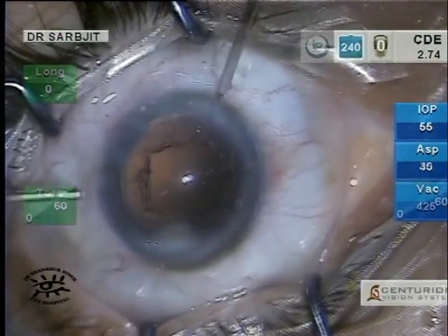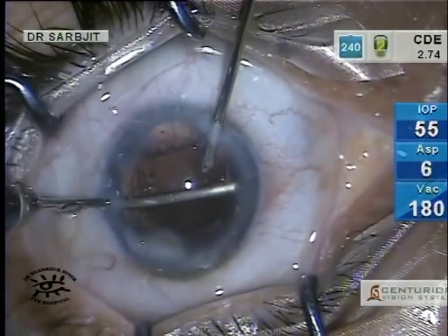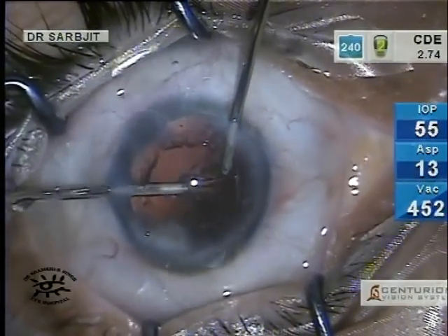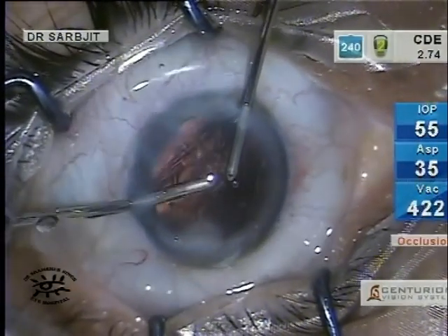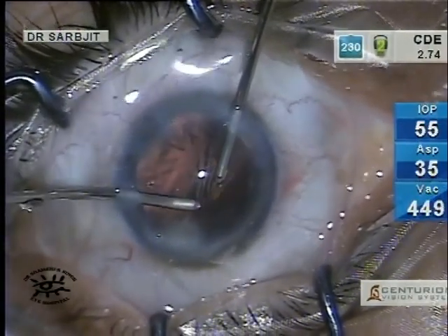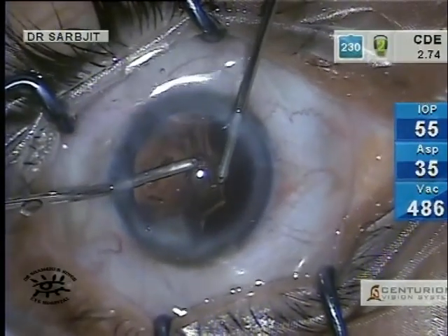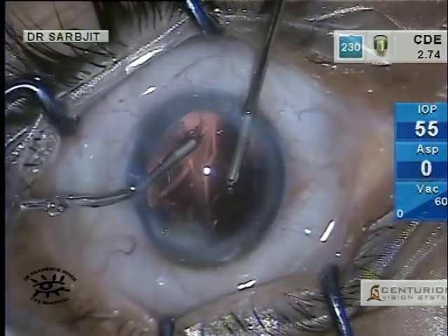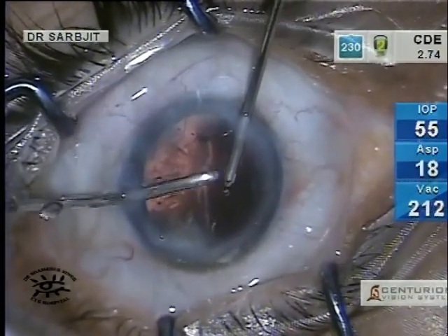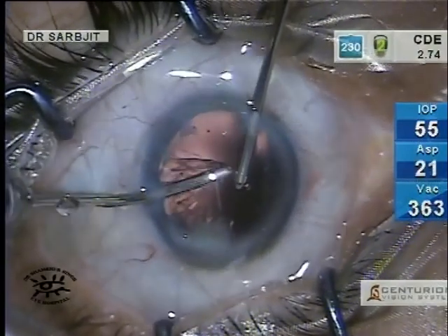I usually inject some viscoelastic at this stage for more protection of the endothelium and do a bimanual irrigation aspiration. Notice that the anterior chamber is very stable — there is no surge at all even at quite a high vacuum.